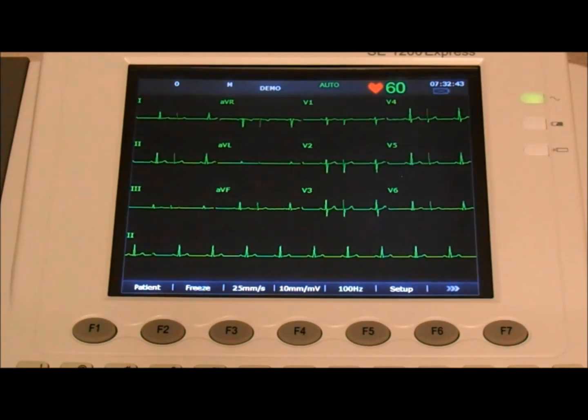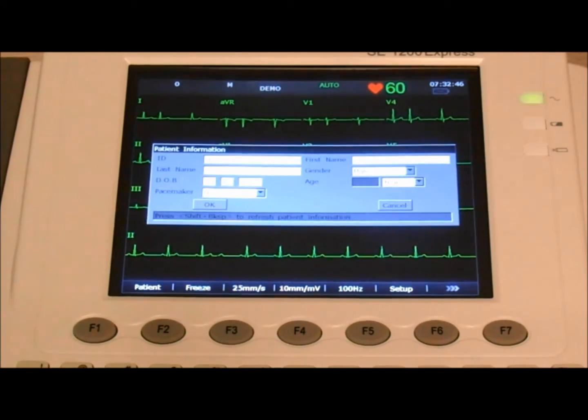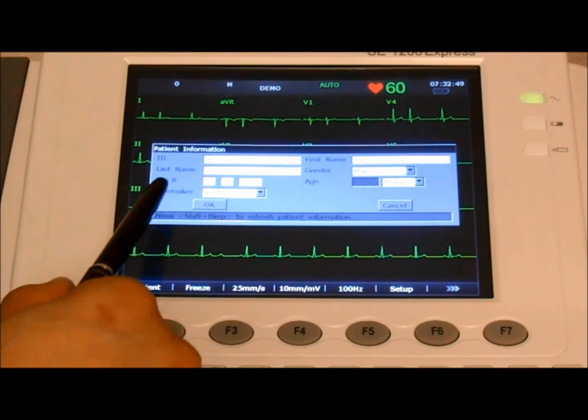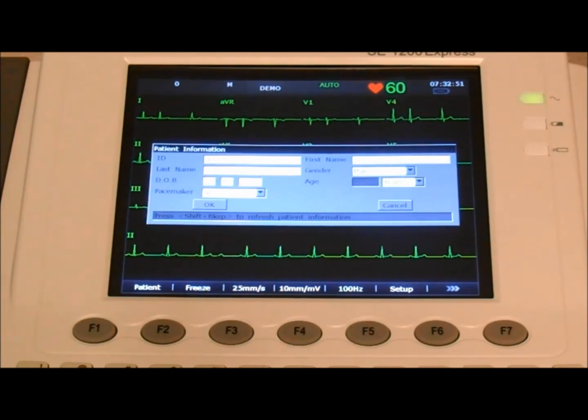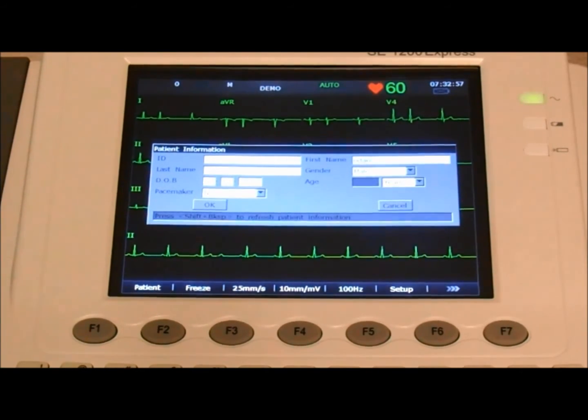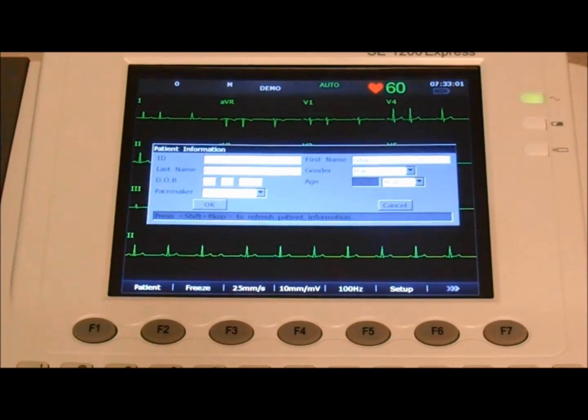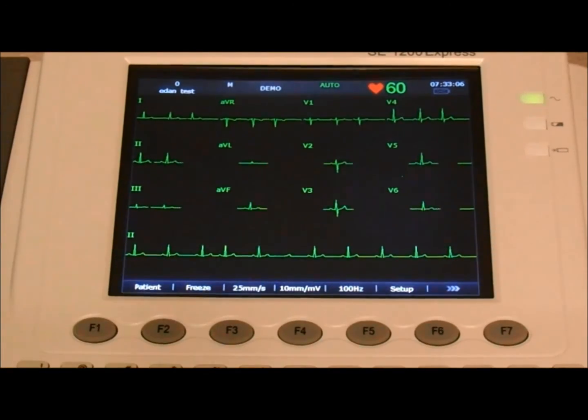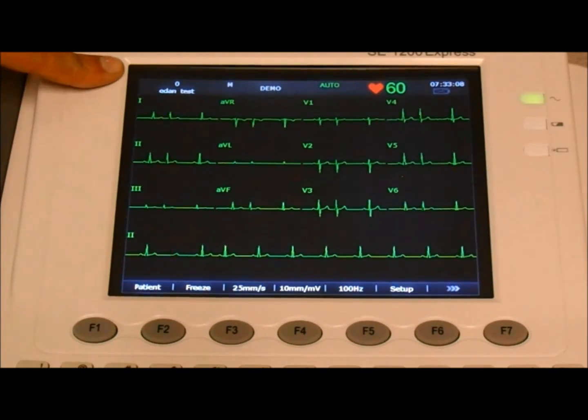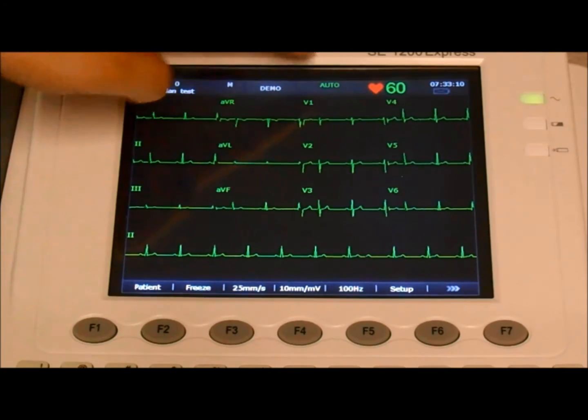So we have a patient connected. If we want to enter the patient name, we press F1. As you can see, we have the information boxes that we selected in the patient info. So we'll enter the first name, Tab, Eden, Tab, Test. And we press Enter. So now we have the patient name, we have the heart rate, and it's auto.